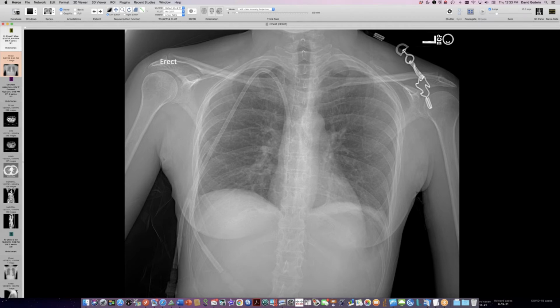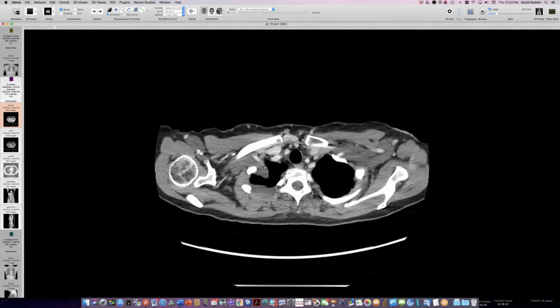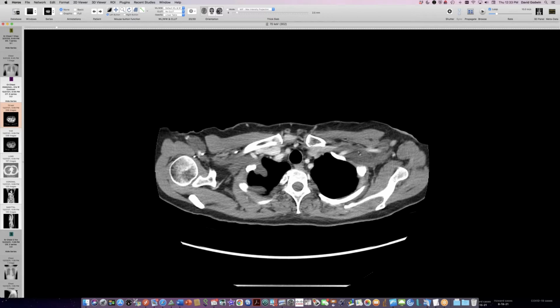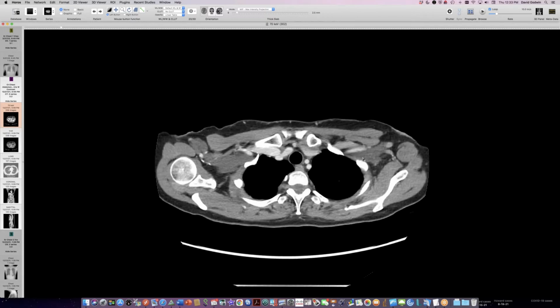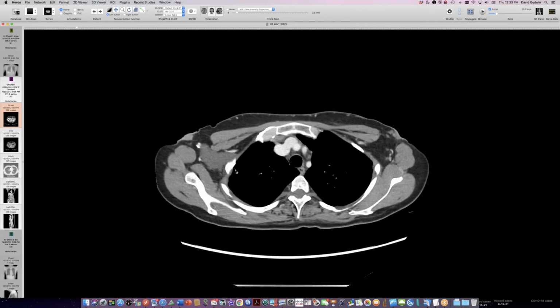And if we look at this on CT, we can see that there are these bizarre apical things here, of fairly low attenuation. And then we look in the axillae here, and we see these lowest attenuation smudgy sausages here that don't belong. So these don't really look like neurofibromas, though, do they? I mean, they're low attenuation, but you got all these things in the axilla.